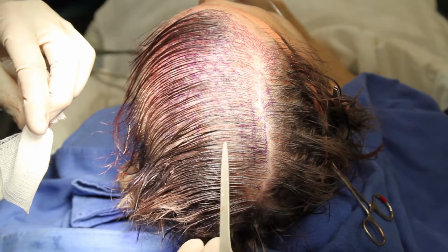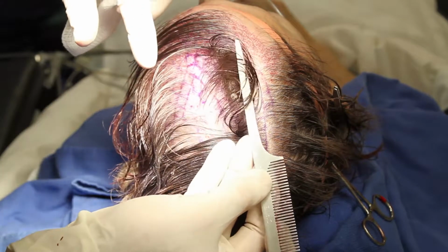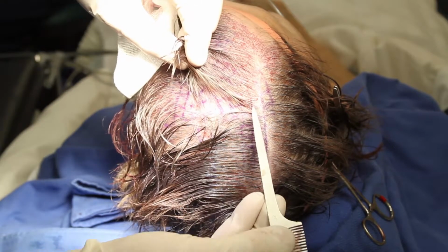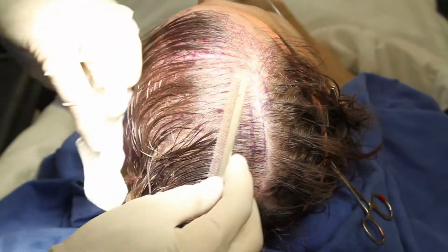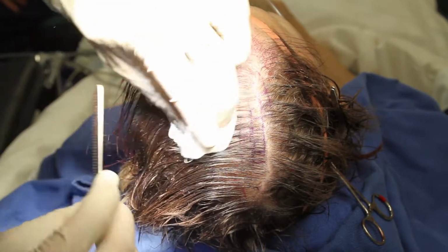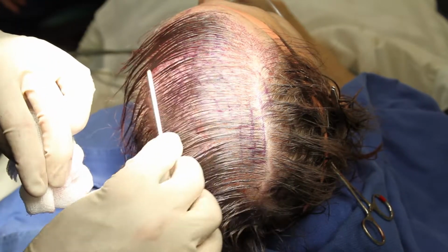So the key to this is really making sure we understand what the patient's desires are, and for him he wants to have very little or minimal scalp showing, and then I've created these little 1 square centimeter boxes, knowing that I can get in somewhere between 20 and 30 grafts per square centimeter, sometimes as much as 35, depending on the scalp, and that gives him a nice full, dense, thick head of hair as we finish.